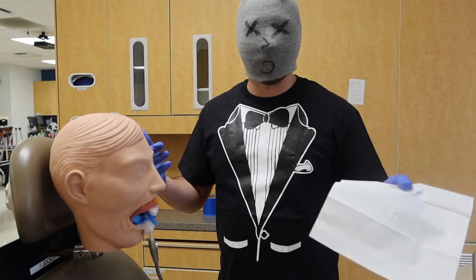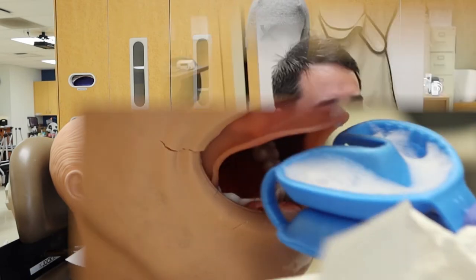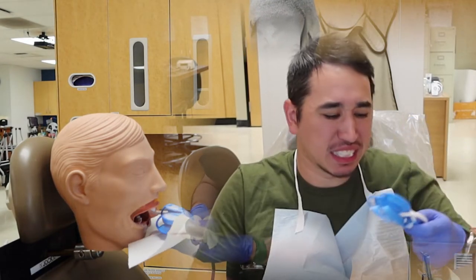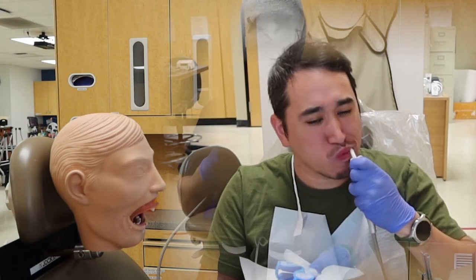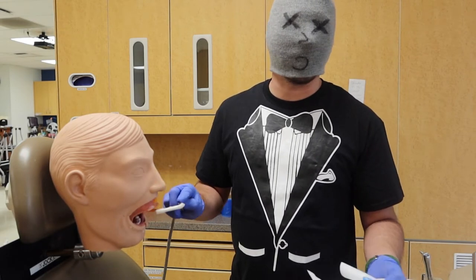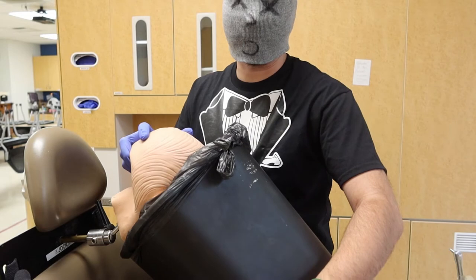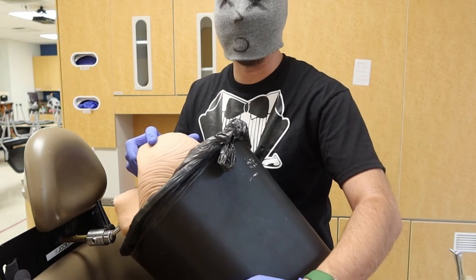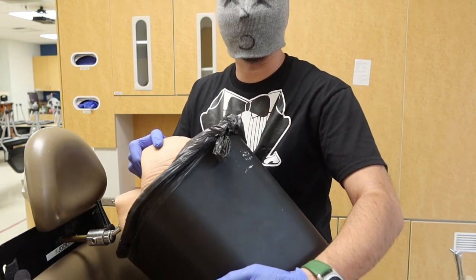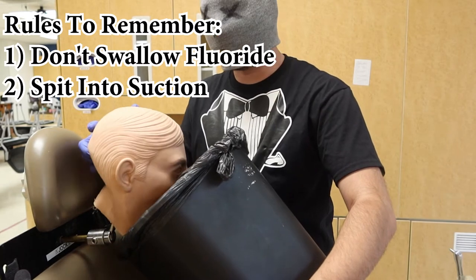After that 60 seconds, go ahead and grab that tray with your paper towel or you can use the patient's bib. Make sure to remove it from the mouth, catch the drool that's going to come out with it, and hand that saliva ejector back to your patient so they can knock out all those different areas where the fluoride is tending to stick around. You might need to go in and comfort your patient as they're rinsing into the plastic trash bin. Remember the key things to watch out for: make sure you're not swallowing the fluoride — make sure that you're spitting it out into that saliva ejector.